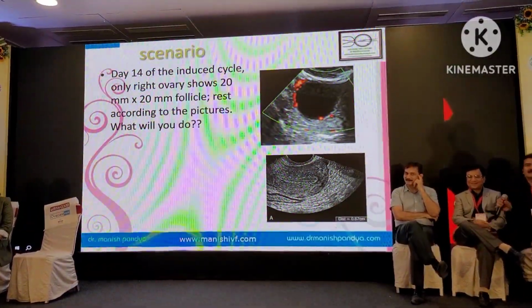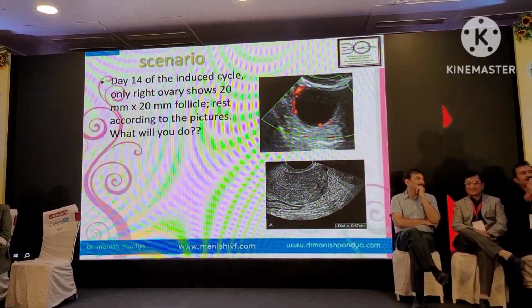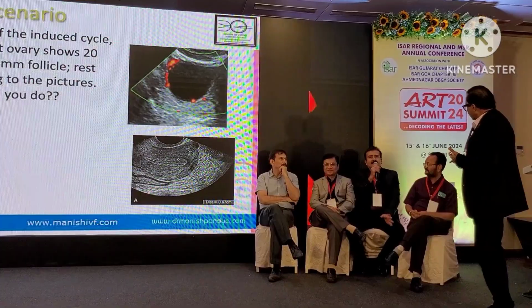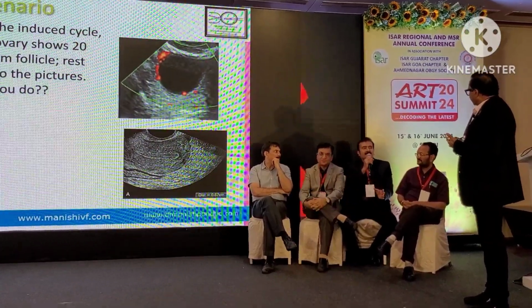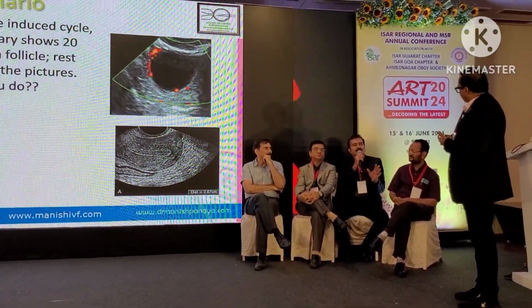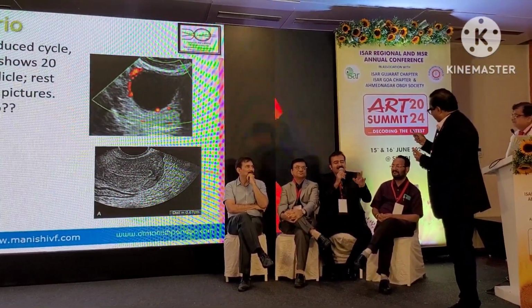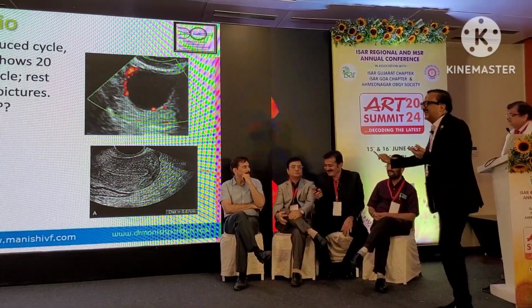You have to wait till the age of maturity. Regarding the size of the follicle, previously in all the literature it has been stated that 18 to 22 mm size. But now the guidelines have changed to 16 to 22 mm. Size doesn't matter. Size matters. Sometimes size matters, but always size doesn't.